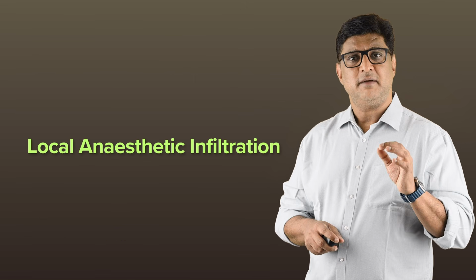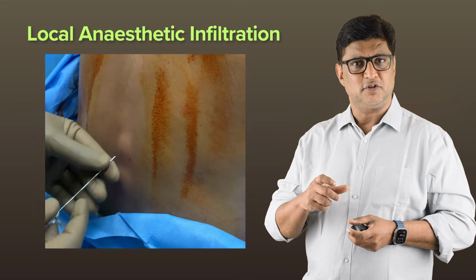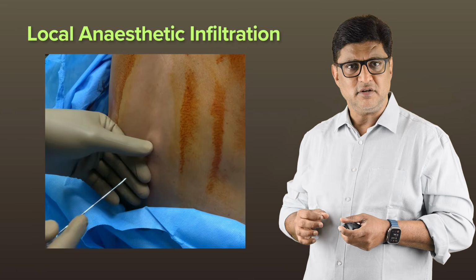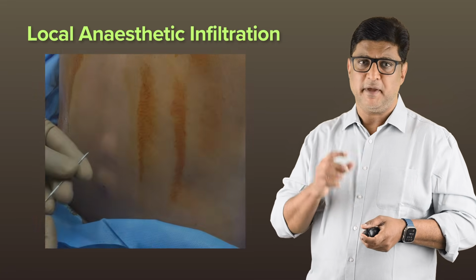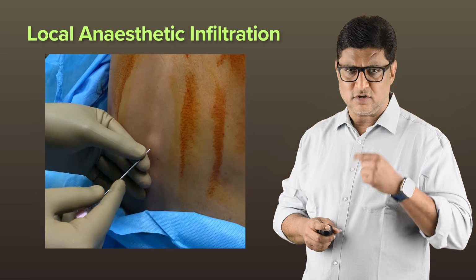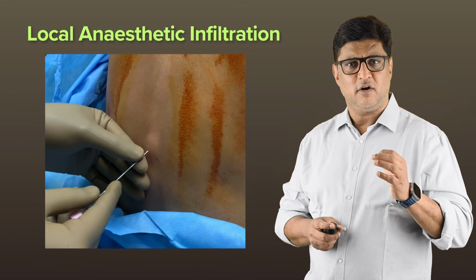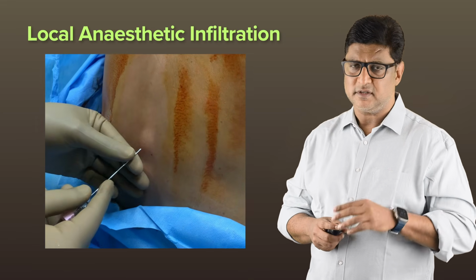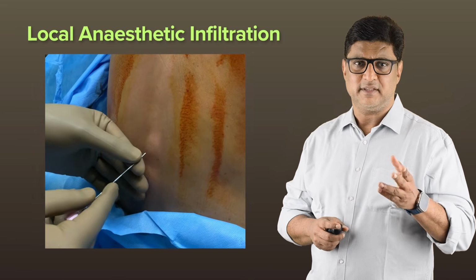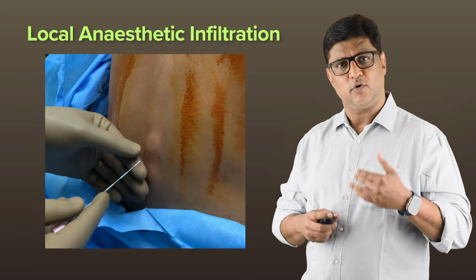So next, when it comes to local anesthesia infiltration, we typically infiltrate the skin and the deeper tissues with local anesthetic solution before introducing the epidural needle. Make sure you cause a proper skin bleb. The local anesthetic is known to cause a stinging action, so you can mix 0.5 ml of sodium bicarbonate to your 2% lignocaine to prevent this stinging action when you're injecting local infiltration.